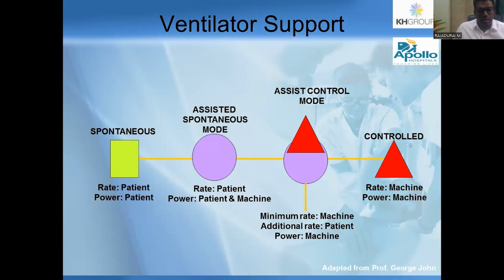So far we have spoken about a little bit of history with regards to mechanical ventilation, the importance of the emergency physician knowing what mechanical ventilation is and what has to be done, which mode has to be selected. A few modes we have discussed, and the variables we have discussed. Five important settings we have discussed before you connect the patient to the mechanical ventilator. Good luck with your mechanical ventilation. We'll keep talking. Thank you very much.